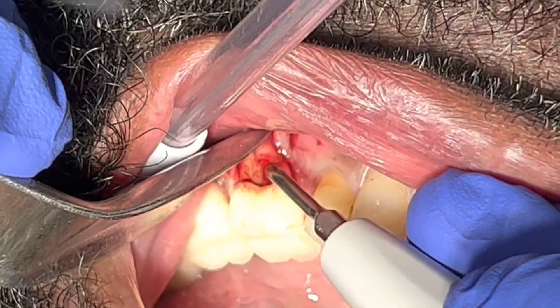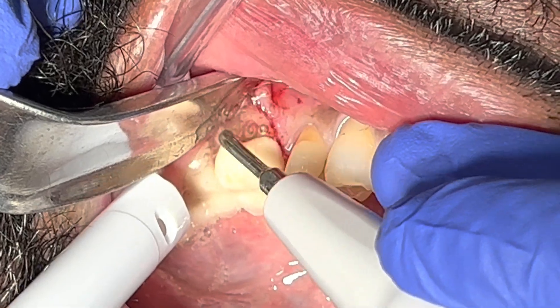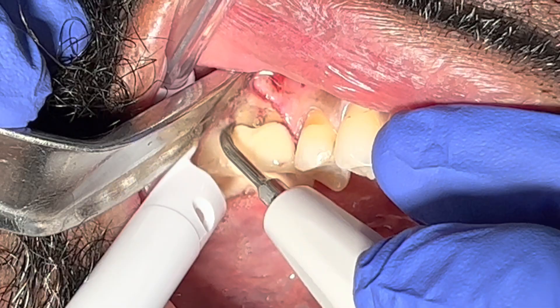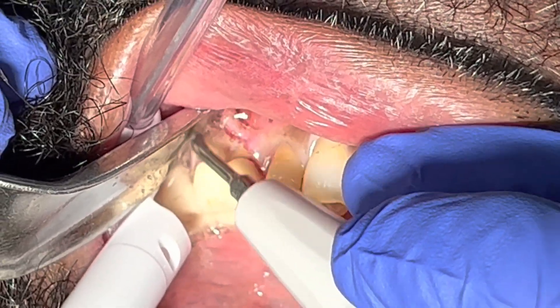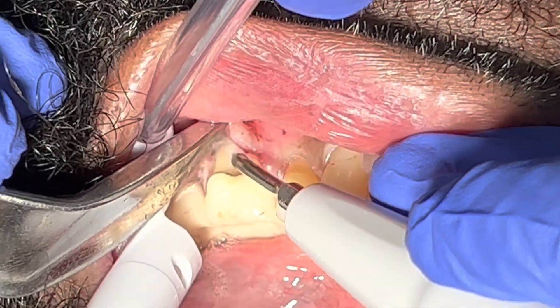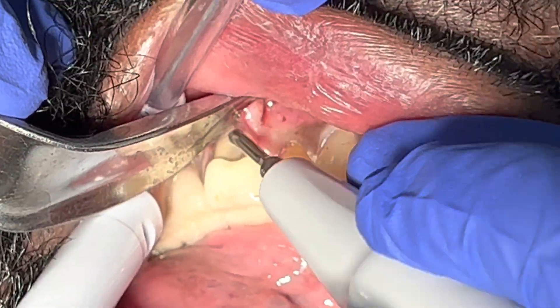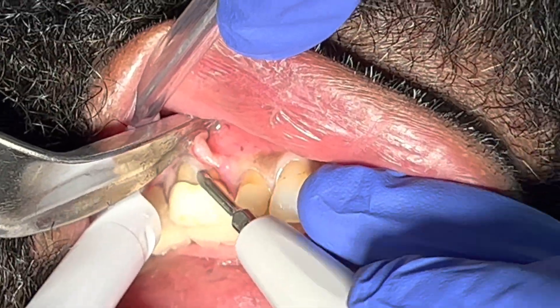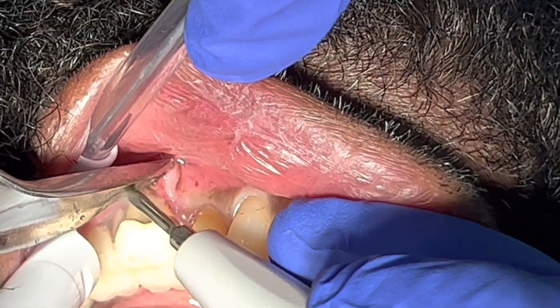Now I'm using the curette and continuing to clean again to make sure everything is well prepared before the bone graft. Even though it's very simple to access, when you want to make the site truly ready for bone grafting, you have to clean really well. I'm using the curette to go under the root and the furcation area as well.